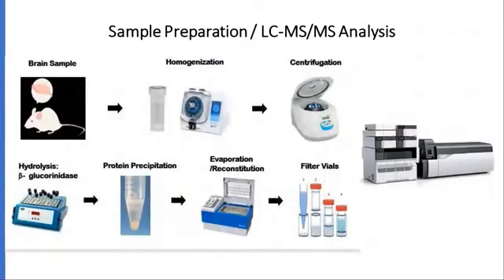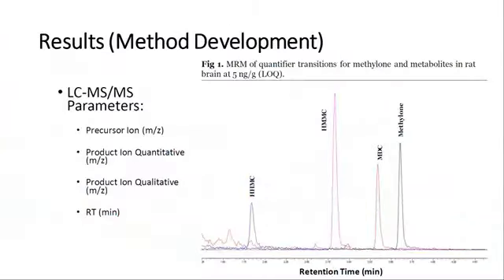So sample preparation consisted of a series of procedures for drug extraction from the brain tissue. This included homogenization of methylone-dosed rat brain in buffer solution, beta-glucuronidase hydrolysis, protein precipitation, evaporation, reconstitution of samples, and filtering for analysis, which was done by using an LCMS-MS instrument equipped with a Synergy Polar-RP column and a triple quadrupole mass spectrometer. After LCMS-MS analysis, different experiments were performed during a process of validation, and the validation process estimates the efficacy and reliability of the method, but also provides any method limitations under normal conditions.